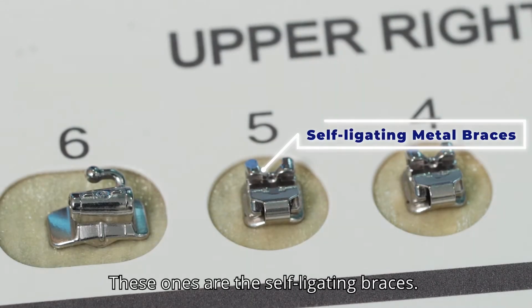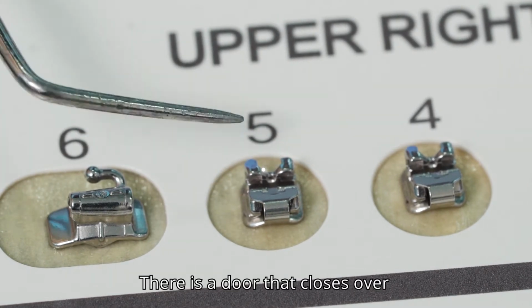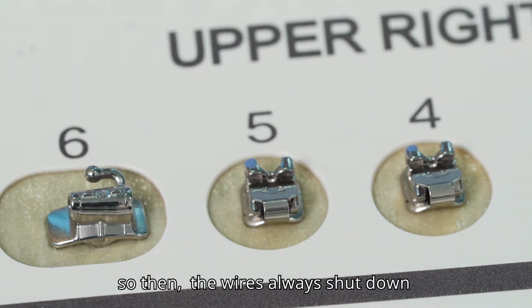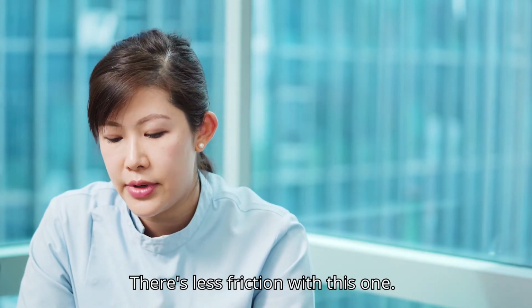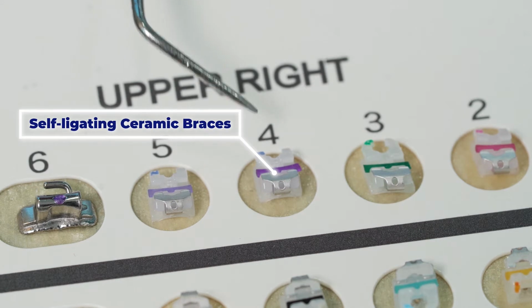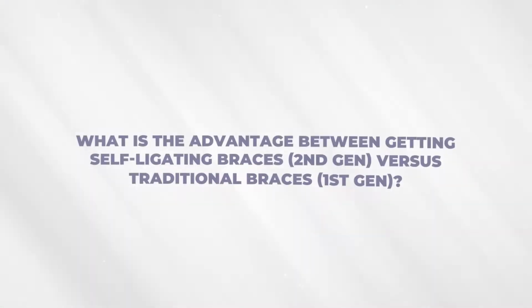All right, so these ones are the self-ligating braces. There's a door that closes over the little bracket right here, so the wire always shuts down underneath this door. So there's less friction with this one. This one is also a self-ligating bracket, but this is a ceramic type, so it looks more aesthetic looking.